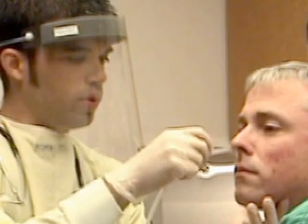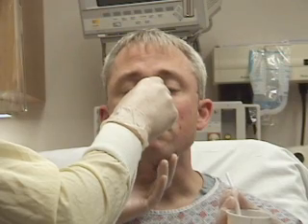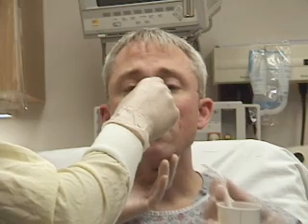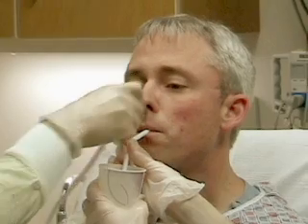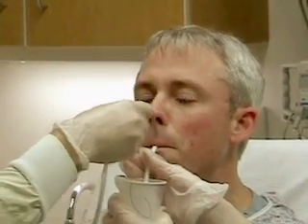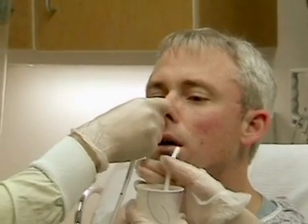Continue to pass the tube posteriorly. The patient may gag once the tube reaches the larynx. Temporarily halt the advancement of the tube and ask the patient to begin swallowing sips of water through a straw. Coordinating advancement of the tube with the swallowing mechanism facilitates passage of the NG tube into the esophagus and prevents entry into the trachea. This is a fluoroscopic view of a nasogastric tube being inserted. As the tube reaches the level of the larynx, advancement is temporarily halted, then inserted as the patient swallows and, once past the larynx, is rapidly advanced.